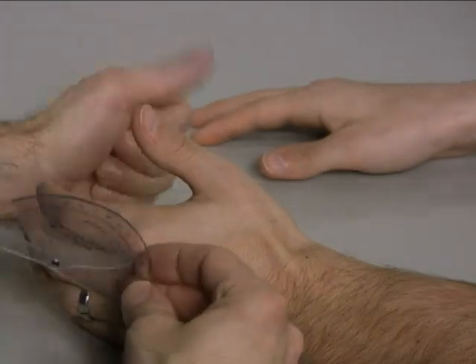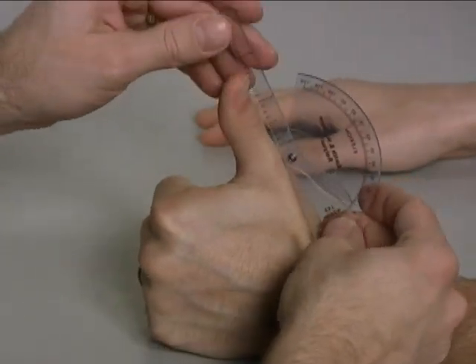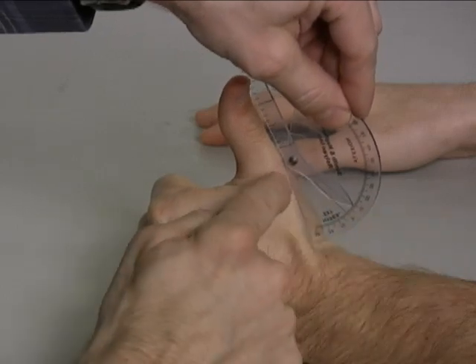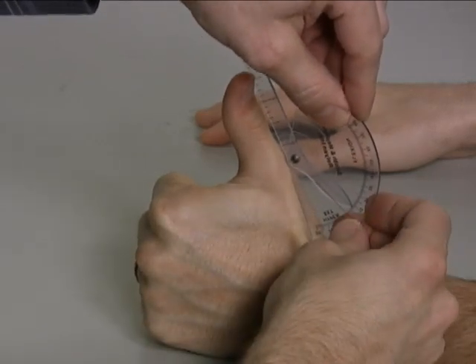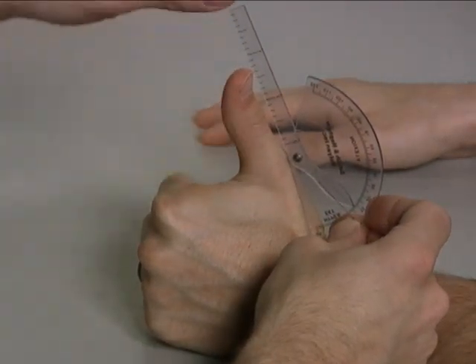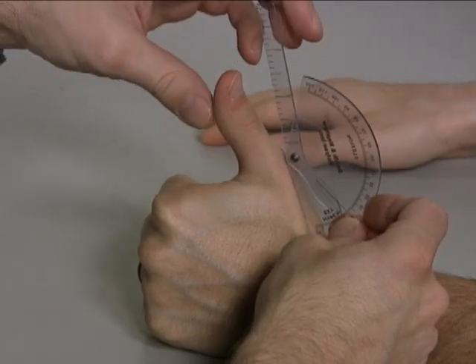Go ahead and bring your thumb back as far as you can. The stationary arm is simply placed flush against the metacarpal. The moving arm is placed flush against the proximal phalanx.